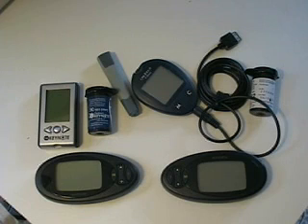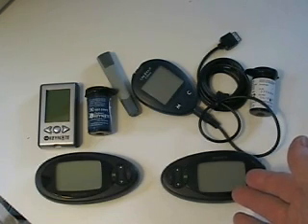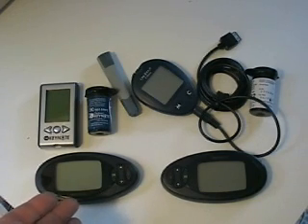So here are the two Dexcom receivers. On the right-hand side is the Dexcom 7, released in June of last year, and the OneTouch Ultra with the calibration cable. On the left is the Dexcom OpenChoice system.